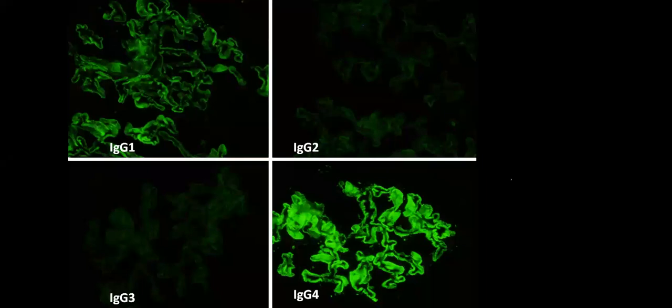when the nephrologist or treating physician used to ask the pathologist whether I'm dealing with a primary MGN or secondary MGN, and there are 100 causes for secondary MGN. And we used to say that on electron microscopy, there are no deposits in the mesangium, there are no deposits in the subendothelial aspect. So I feel it is primary membranous, but that is not correct.